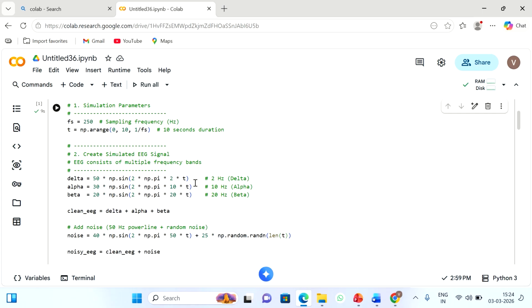So noise is compulsory, and I have already told you that the EEG signal is very low in amplitude, because the conductivity will be very small. That is why we are taking the low amplitude, low frequency EEG signal. In case of ECG, to some extent the magnitude will be higher, because we are positioning the electrodes around the heart skin.